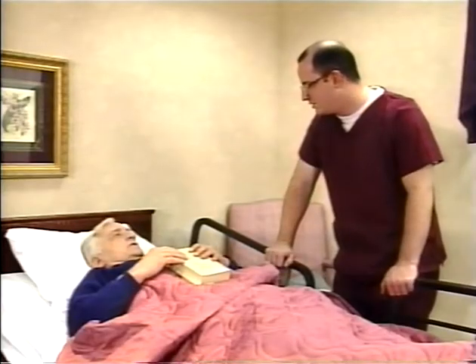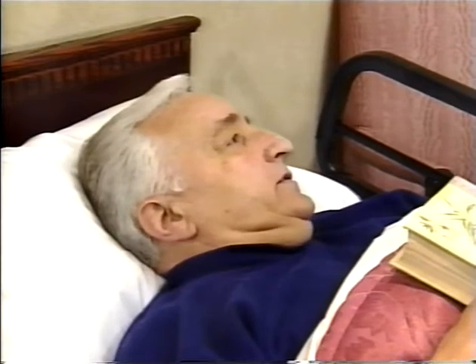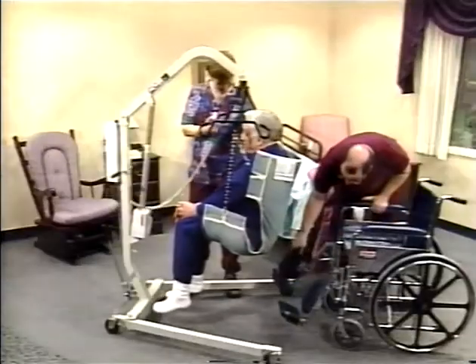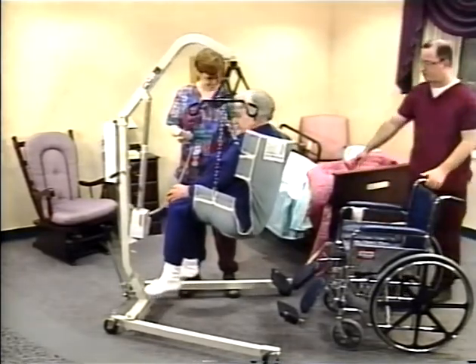Always explain each step of the lift to the resident before you begin. Someone who knows and understands what is happening or is about to happen is less apprehensive and more cooperative. Team members must remember to communicate also. The resident should be facing the caregiver with his weight centered over the base of the lifter.